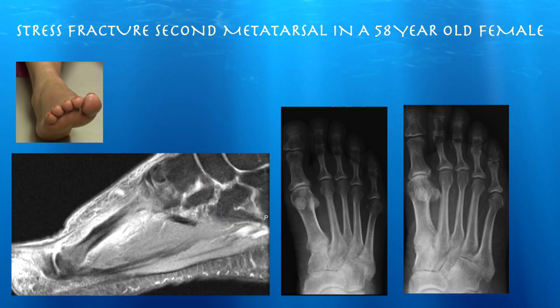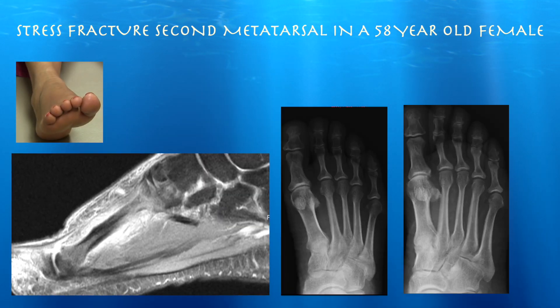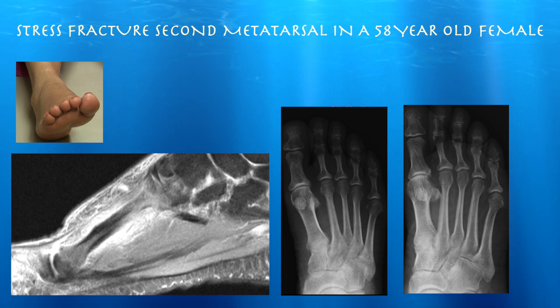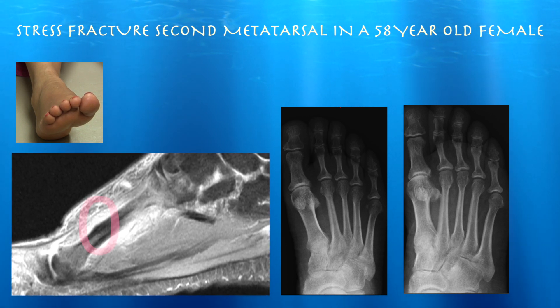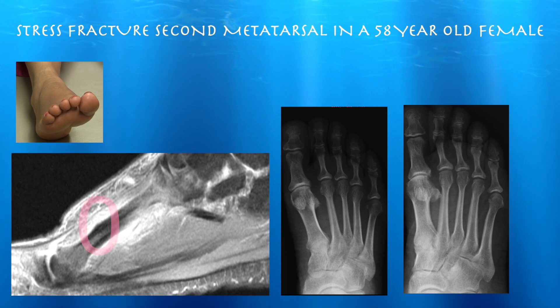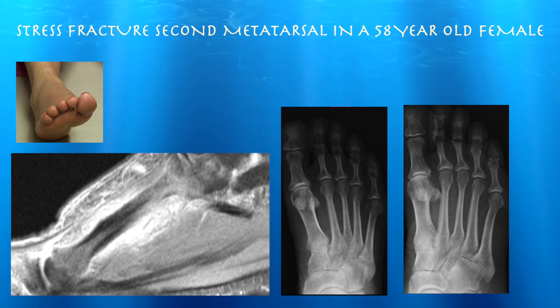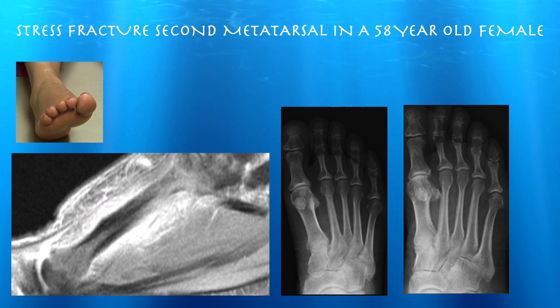This is our patient, a 58-year-old female, here for evaluation of right foot pain for three weeks. We get an MRI which shows a healing stress fracture of the second metatarsal with significant bone marrow edema in that region. It also showed a neuroma in the third web space. We're going to evaluate that on ultrasound today.